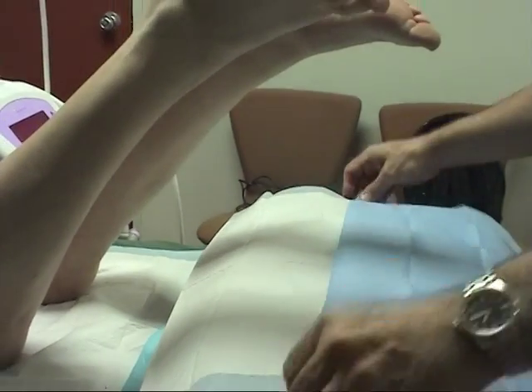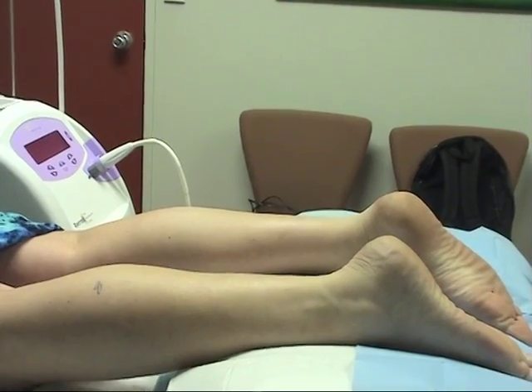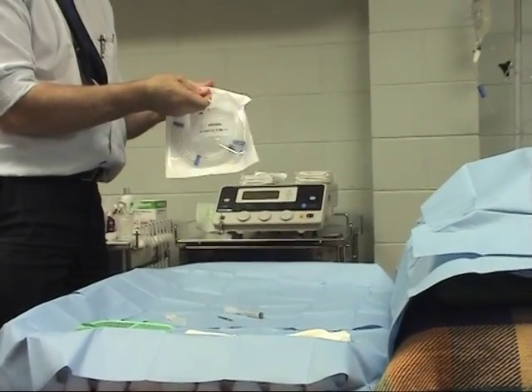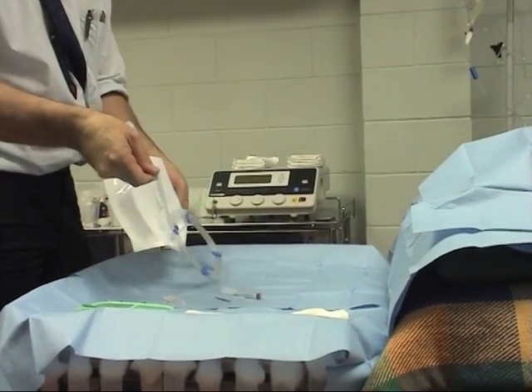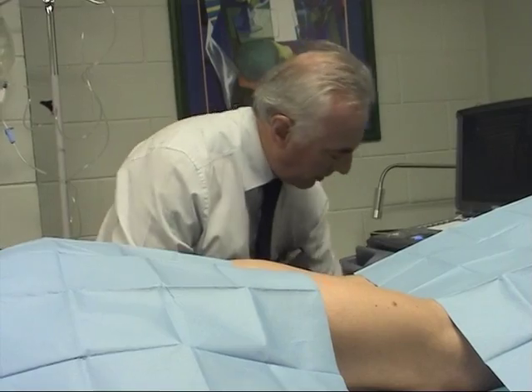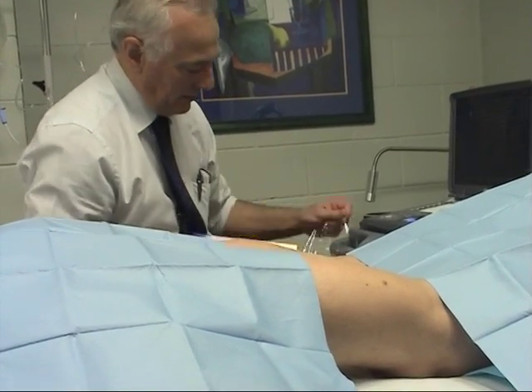I'll just get you to lift your feet again briefly for a second, just put that under there. That's good, and then relax again. So what I'm going to do is just run some gel over your legs — it'll be a bit cold. And then we're going to put a bit of local just at that point down the bottom here where the bottom end marker is, and that'll make it numb so you don't need to feel anything at that point.